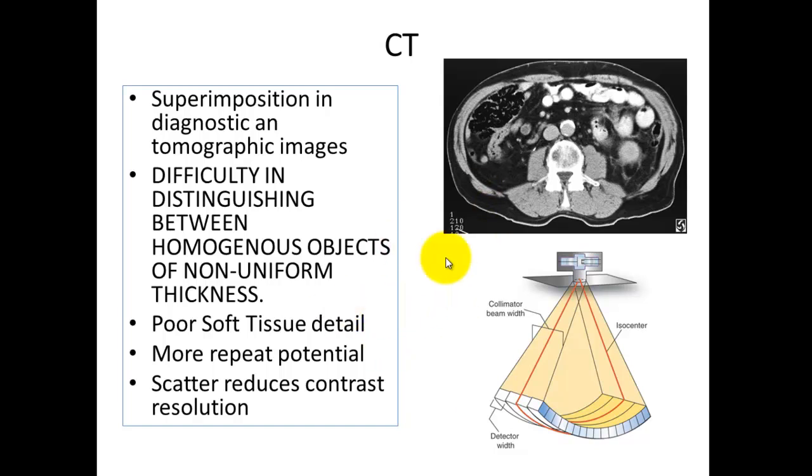If we take a look at this image here, here is our X-ray tube, and here are our sets of detectors. With these detectors, you can see that you have 4 rows. 1, 2, 3, 4. If we spread our beam of collimation across these, we also have the ability with CAT scan to take multiple slices simultaneously. So in this case, for each time that the CAT scan moves around the patient's body, we would get 4 simultaneous slices.